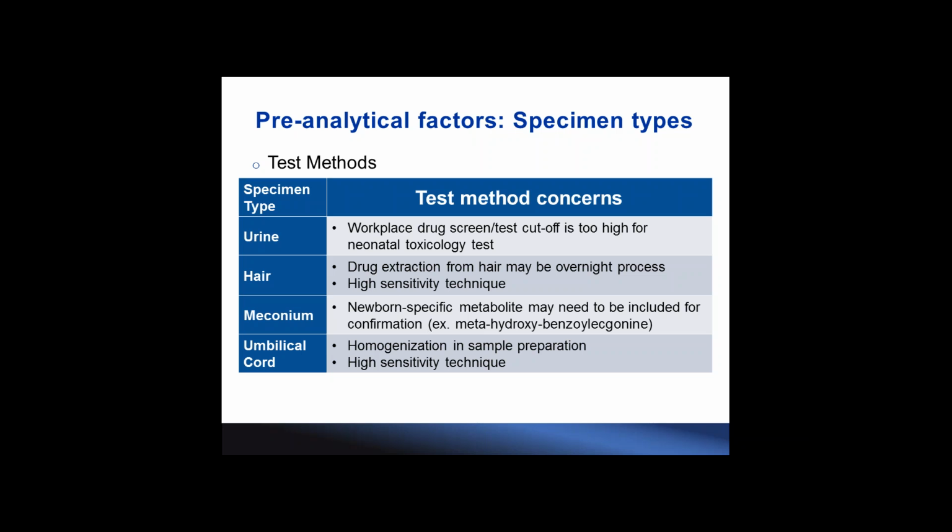Make sure that their cutoff is not set too high, because commonly the immunoassays we're using may be set like a standardized SAMHSA cutoff, and that may be too high for neonatal drug exposure cases.